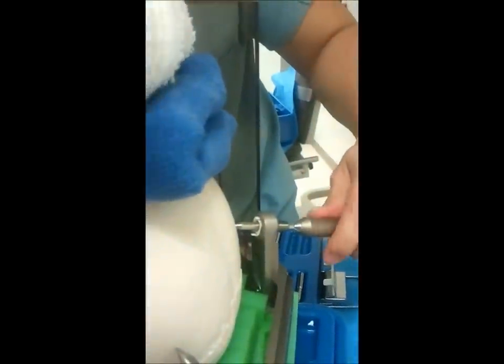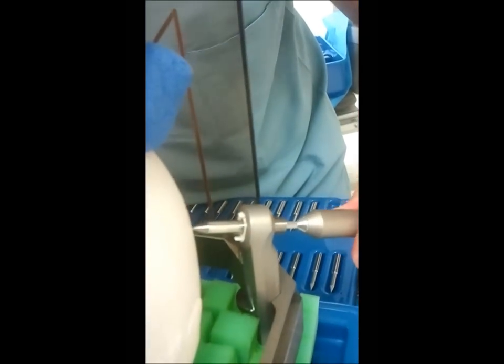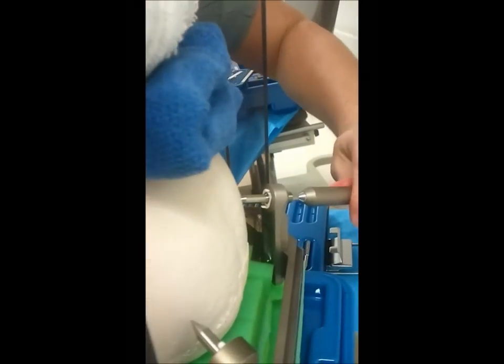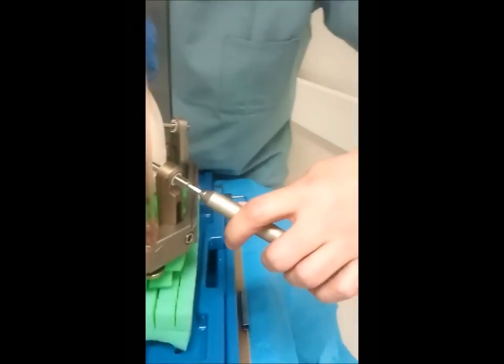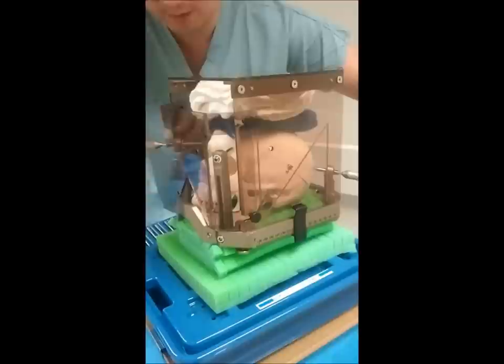Now you can start getting those closer to the skin and the simulated bone. You ideally want to place in opposite corners. Your ideal screw length placement will have the threads barely or not showing, which is ideal. Sometimes you have them further out, but that's hard to simulate in this environment. As we screw these in, we want to get good purchase on opposite corners before we do our final tightening.